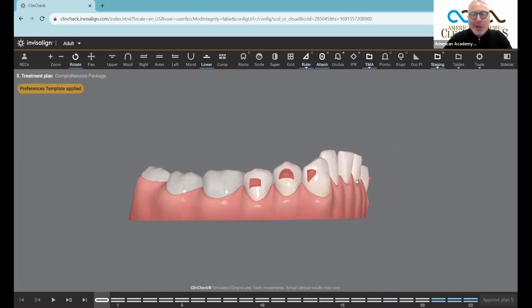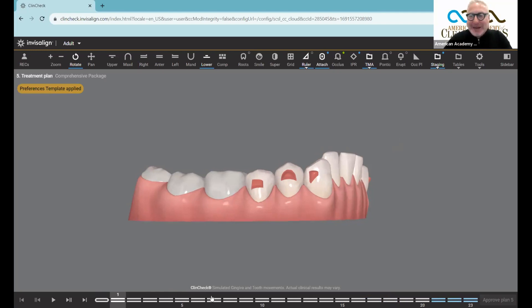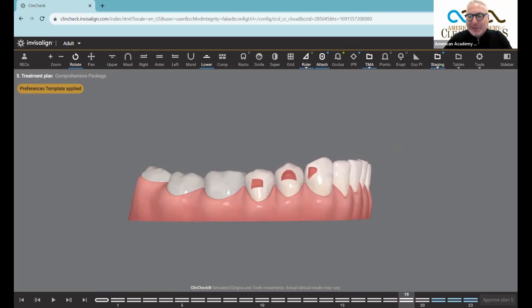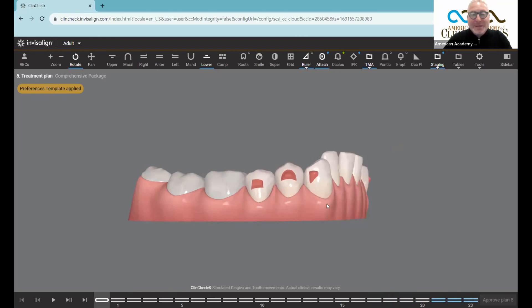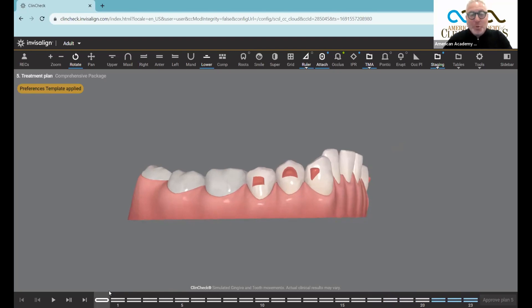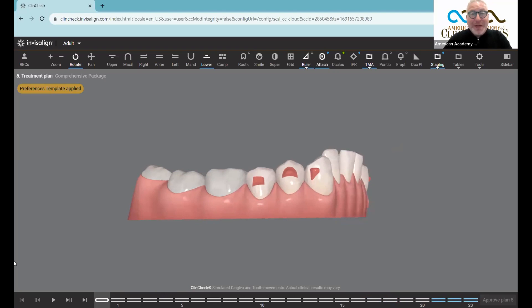We have a lower anterior crowding case here and the lower anterior teeth are coming forward. And the million dollar question is, will this movement — this buccal movement — will that cause a recession? Will that move through the buccal plate of bone?